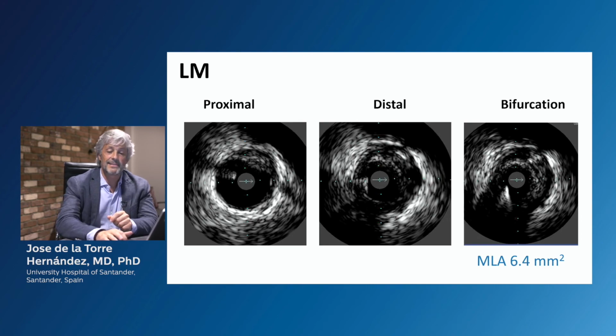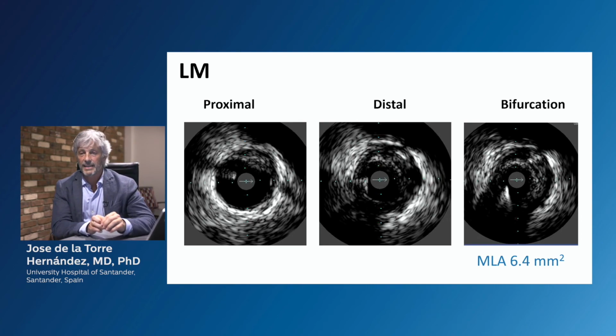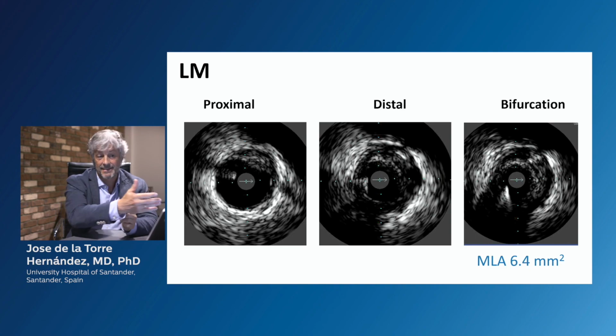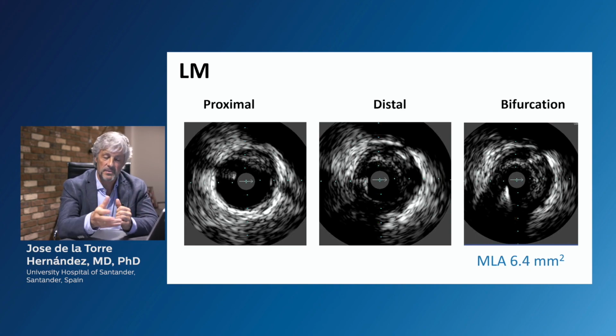And in this case, I stop here because this case is planned to do a PCI procedure, repeating the physiological measurements and IVUS, just being a bit more distant from the STEMI, the ST-elevation MI, that was 2 weeks ago, and in 2 weeks we plan to study this patient.